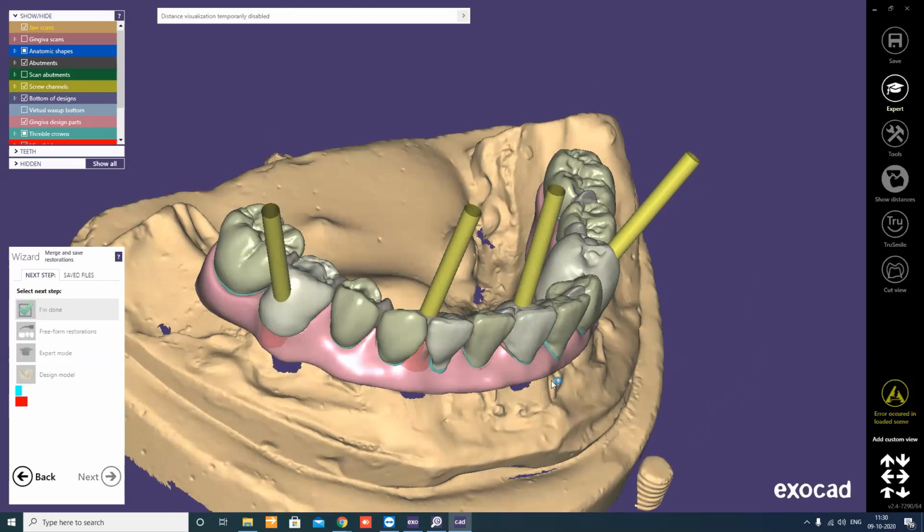Now it is calculating for the final. So you can view everything, abutment, the Malo framework. Now abutment Malo can be one piece if we had selected as a screw retained, but we selected two piece just to show the custom abutments and also this. There is a lot of calculation to be done.